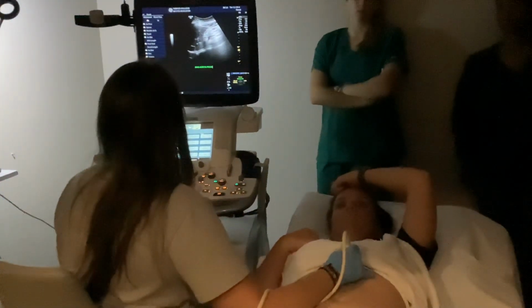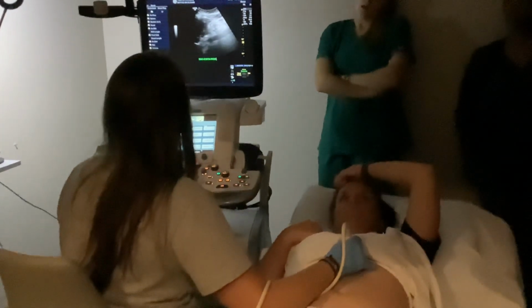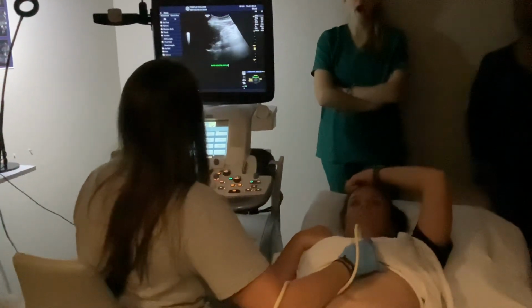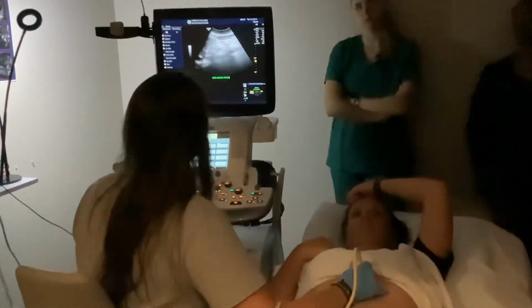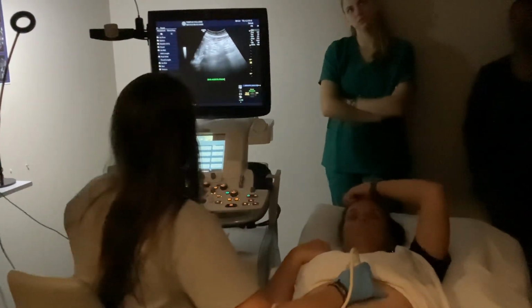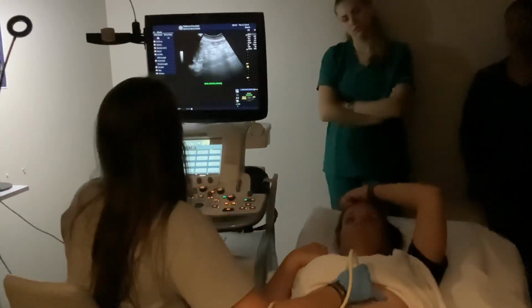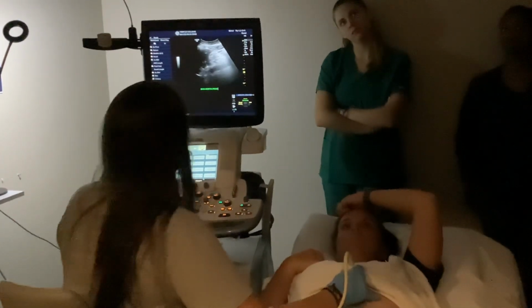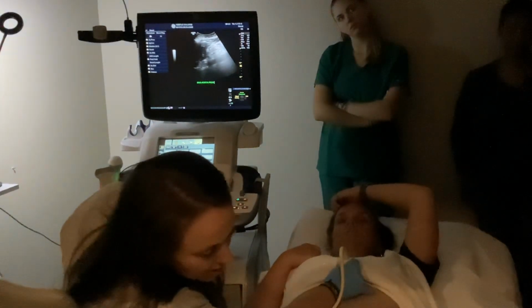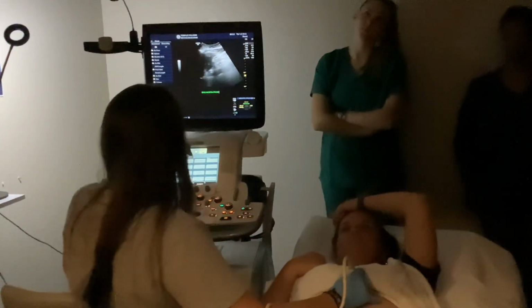Okay. So when we're talking about the aorta, it sits slightly to the left in the body. So I'm gonna come all the way up kind of in her sternum area here. So when we're down here, we can see it, but we're looking at the midsection here. Okay, we wanna start with the prox. So your landmark for prox is going to be, I wrote it down on here. What is it? The opening of the diaphragm and the gastroesophageal junction.